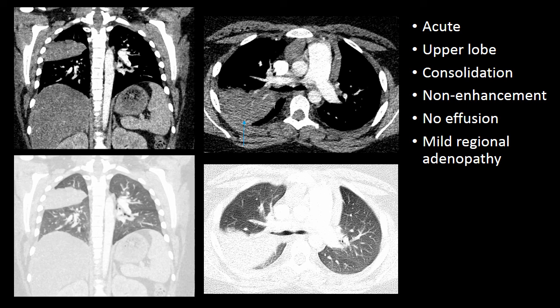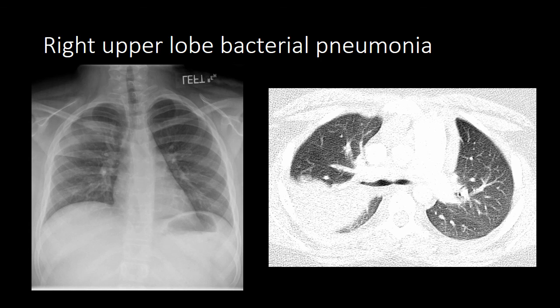Remember that airspace filling can occur from many different etiologies, but commonly fluid, pus, or blood. The radiographic appearance of airspace filling by different types of fluid, pus, or blood can be very difficult to distinguish, and you often have to rely on your clinical information. Again, this was a right upper lobe bacterial pneumonia.